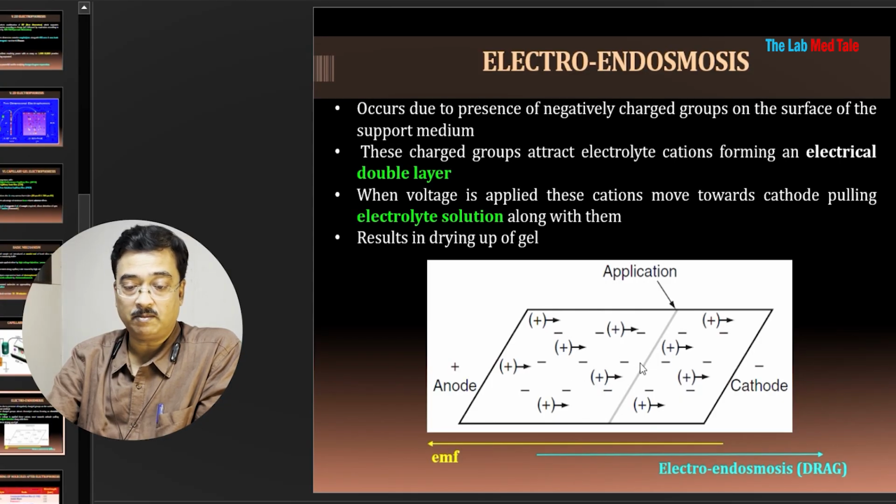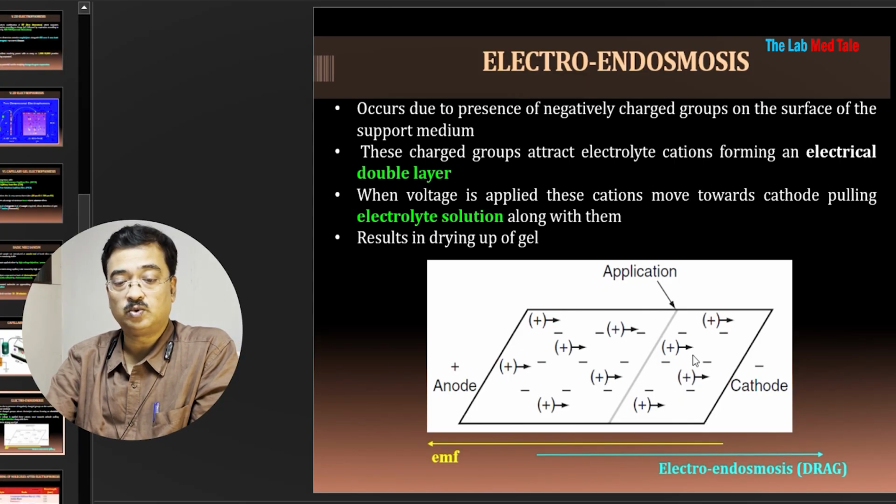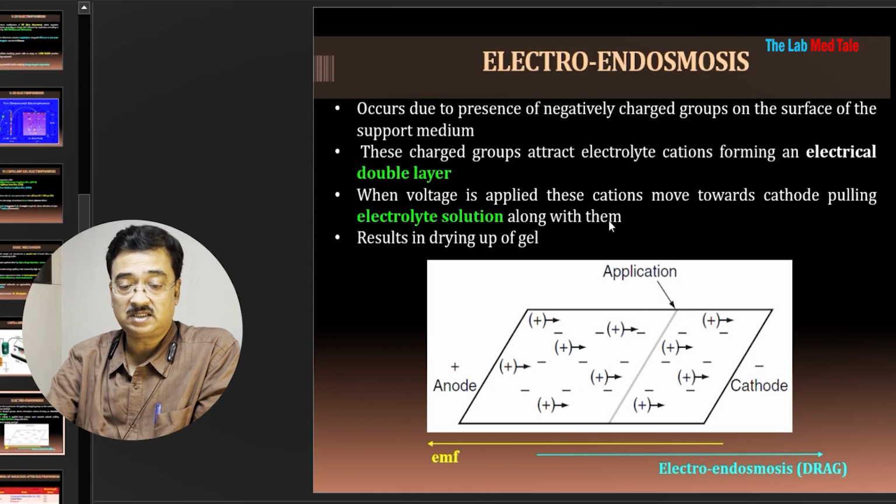When the electronegative molecules are moving to this side, there is a counter-running of positive ions on the other side, and sometimes these ions push the weak electronegatives towards the cathode. This is a typical impurity effect, and it happens with agar gel.